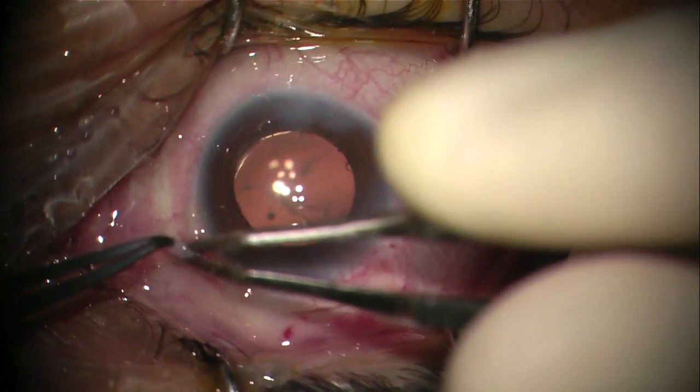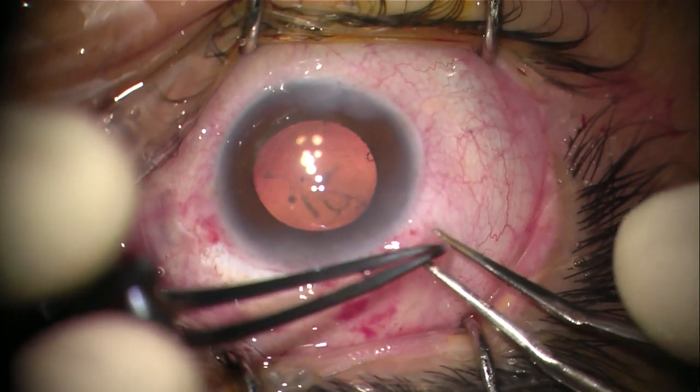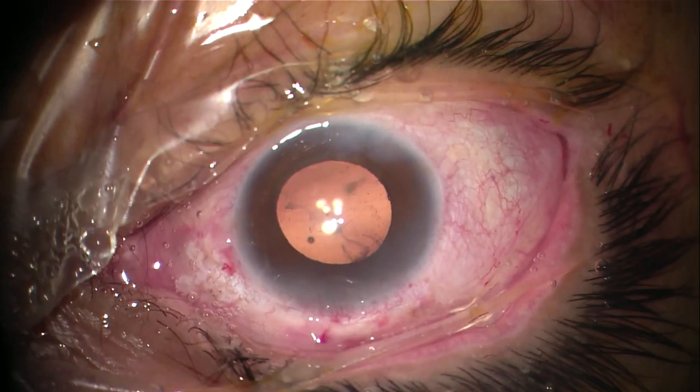The conjunctiva can simply be closed with cautery, and this concludes our surgery. Thank you so much for watching.